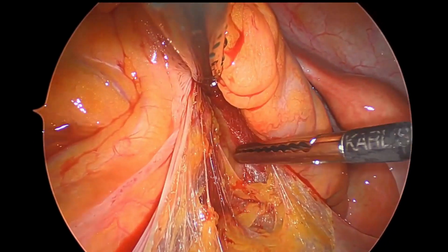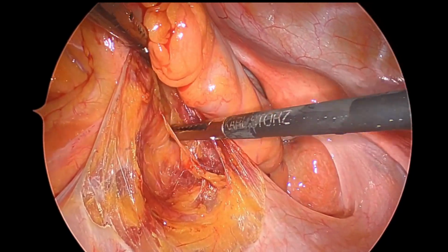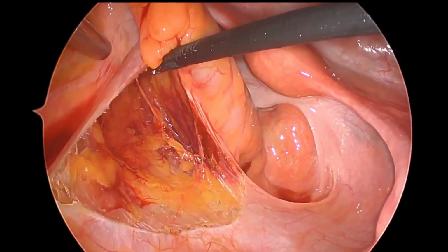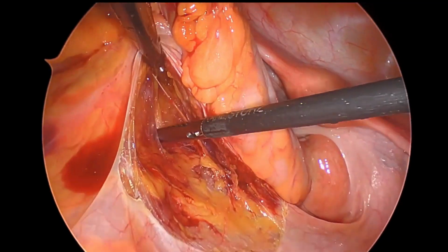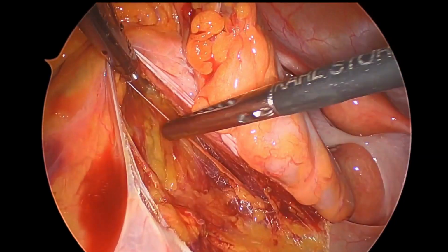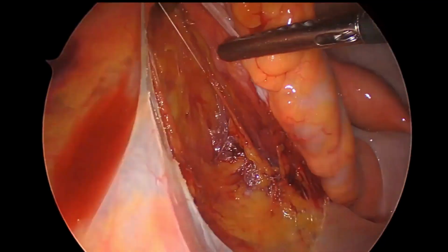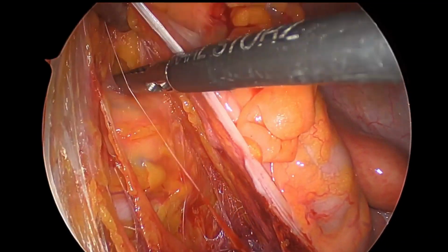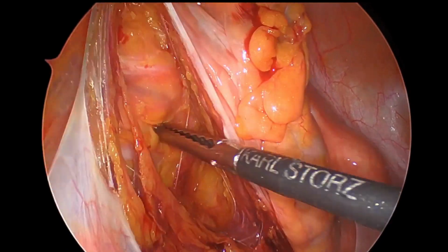And a really important key component to doing this dissection laparoscopically is to really give strong tension with your left hand, the hand that is not doing the retraction, up towards screen left. And so here you can see that there's a little bit of blood, and one of my tips was bleeding is bad. So anytime there's even a little bit of blood, you have to question if you're in the right plane. And there you saw that we could visualize left common iliac, and that is an indication that we've gone too deep. And so the maneuver here is to actually try to get the plane reestablished.